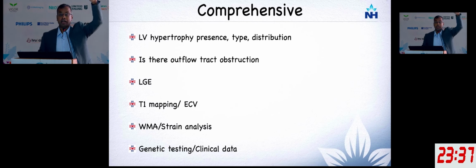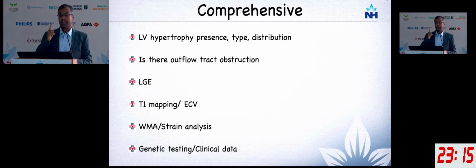Look at wall motion abnormalities. Start looking at strain, because that gives us a lot of information in cases where we are not 100% sure. Finally, genetic testing is very, very important. And of course, clinical data, you can't do anything about.